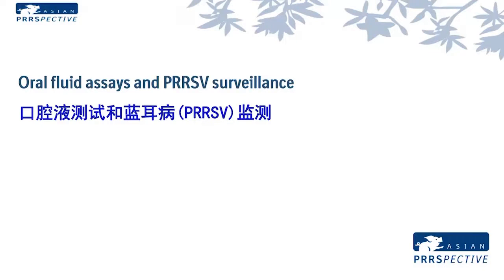And so you can see he was able to detect plenty of PRRS antibody that came from the spray-dried plasma. To confirm these results, we sent the same samples to the Boehringer lab in Ames, Iowa, and you can see that they essentially duplicated the results in our lab. So that's a word of caution. If you're using spray-dried porcine plasma, you're likely to detect antibodies against any of the pathogens in the region from which the plasma came. So, a word of caution.